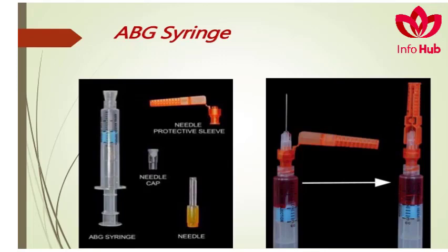Arterial blood usually has a high pressure, so it will push the plunger backward once you attempt a radial tap, and it will be clearer blood than venous blood. You can take venous blood also, but that will then be called venous blood gas analysis. Ideal is arterial blood gas analysis.